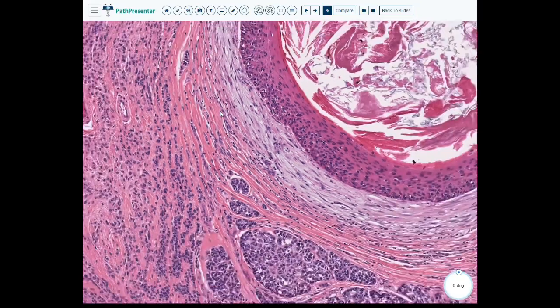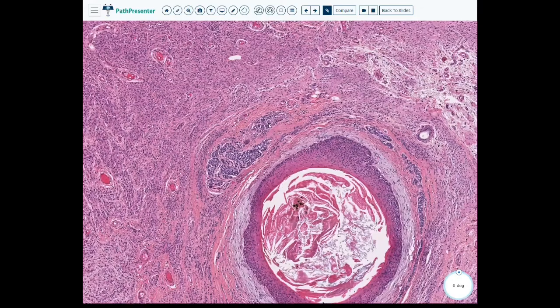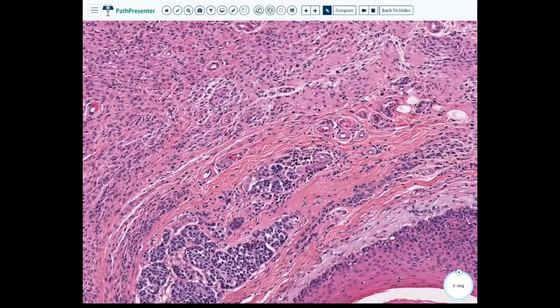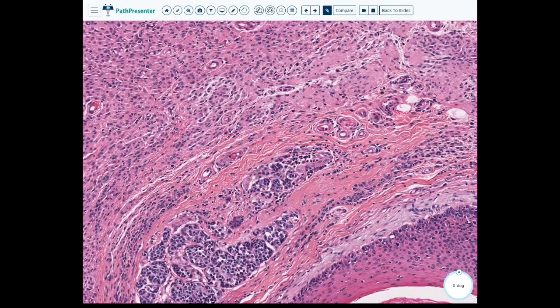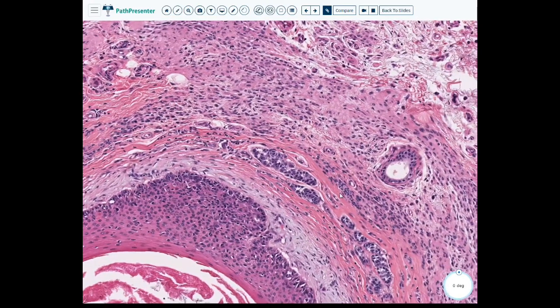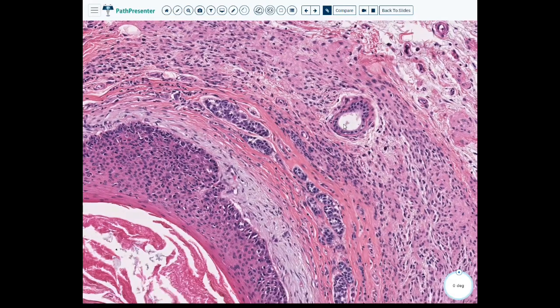Okay? Maybe go to an area where they aren't more lobular in appearance, just to make it a little easier to see, like over here. So I feel like this is a good contrast where we have these very immature appearing, irregular melanocytes, and then over here we have the maturing variant. So you can see the difference here. That's probably a better area to show you. And then again, we see how this is coming underneath the adnexal structure.